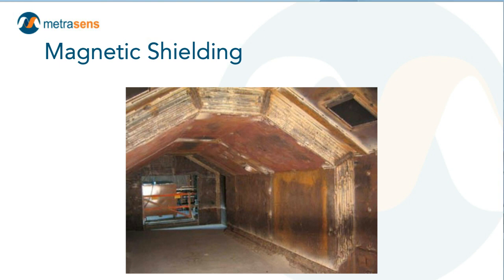There is actually the potential that if, for example, we really had to shield the left wall of an MRI room and we were throwing lots and lots of steel at it, the magnetic field from the MRI would be attracted to the left wall and all of the steel in it. We might actually need to put a bunch of steel in the right wall just to compensate, not that we need to shield the right wall.